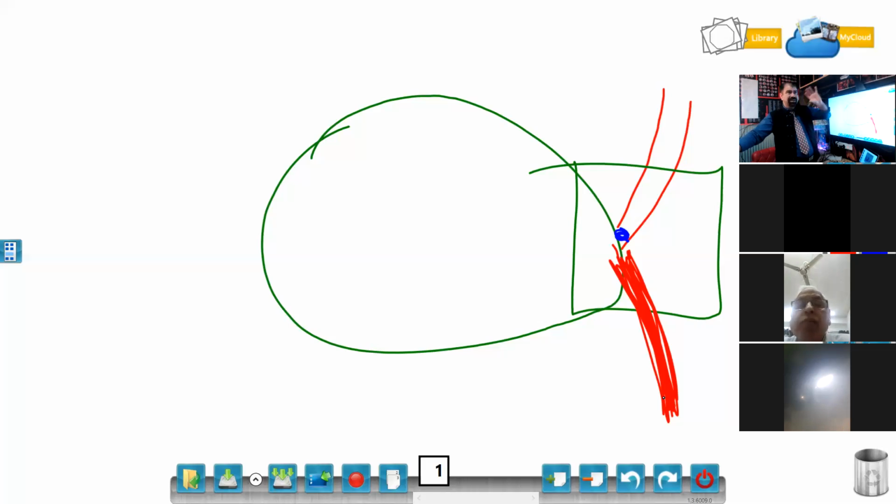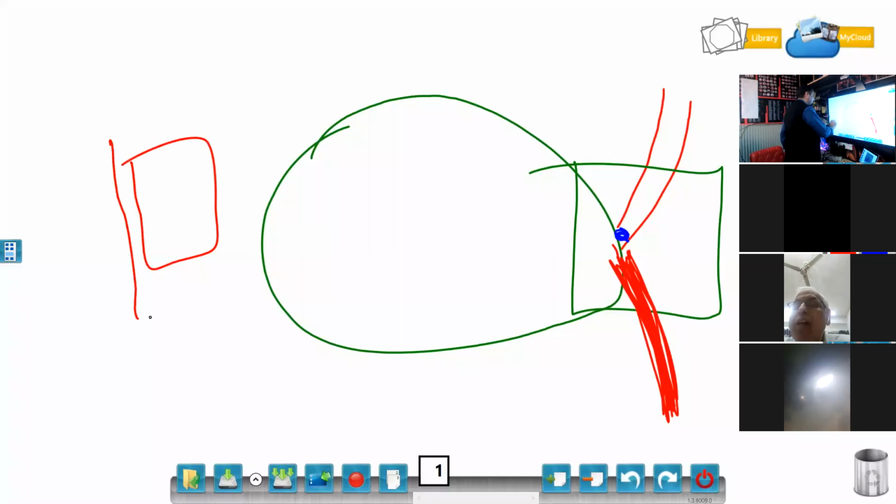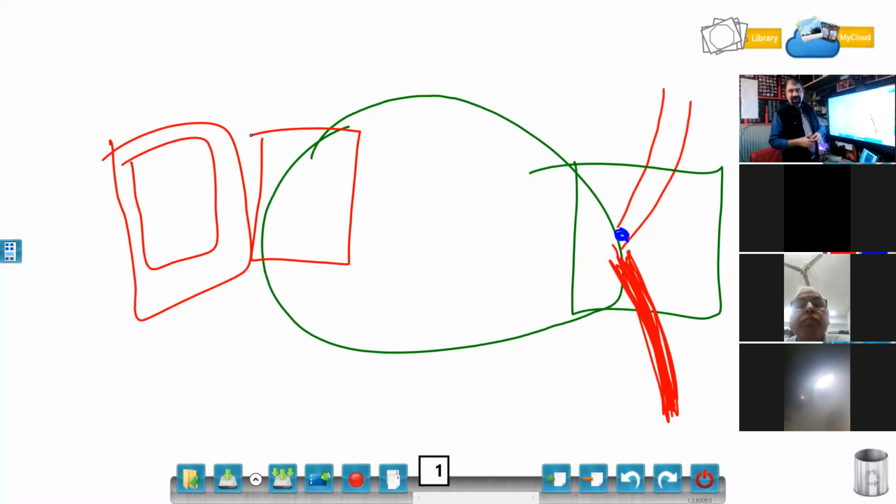So now what I can do, I can turn the table around. If I am searching for a calculus, why not take this color box and put it on the lower ureter area, I mean at the UVJ? Why not drag it with a slight movement upwards, and if at any point it gives me this twinkle artifact, then why not trace from that twinkle artifact, and that twinkle artifact will take me to the ureter calculus. So you can try this in your patients.